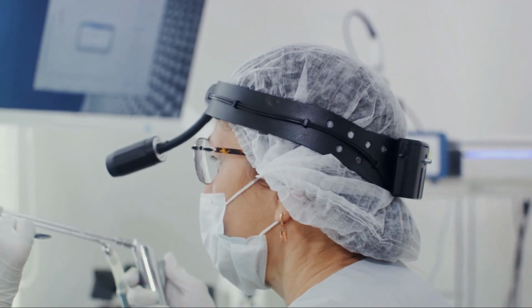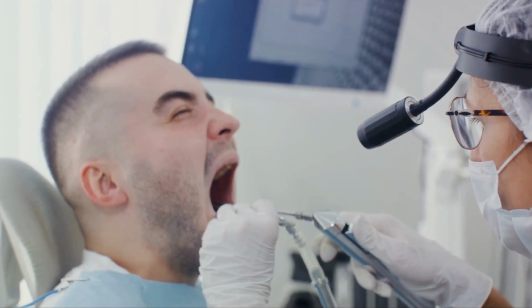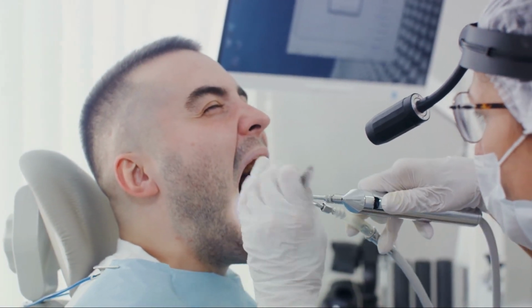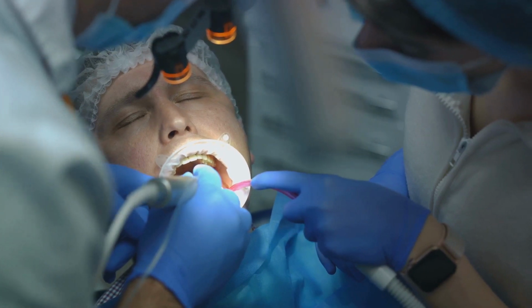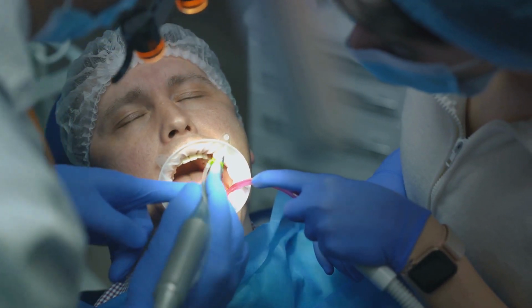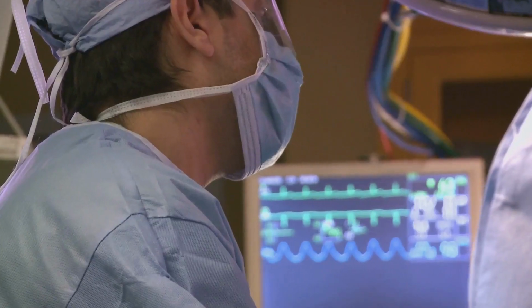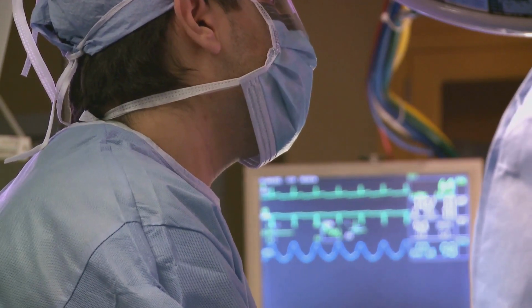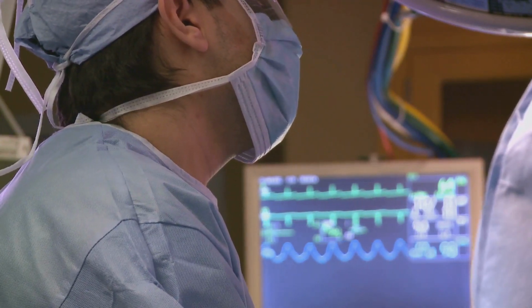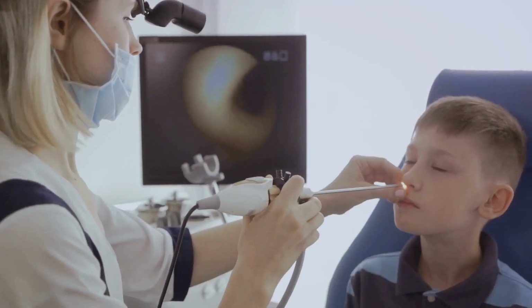Next, the laryngoscope is inserted into the mouth, pushing the tongue aside to visualize the larynx. The tube, guided by a stylet, is advanced through one of the nostrils, down the pharynx, and into the trachea. It's crucial to advance the tube gently to avoid trauma to the nasal passages. Once the tube is in place, the stylet is removed. At this point, correct placement of the tube in the trachea is confirmed by observing chest rise and fall with ventilation and listening for bilateral breath sounds.